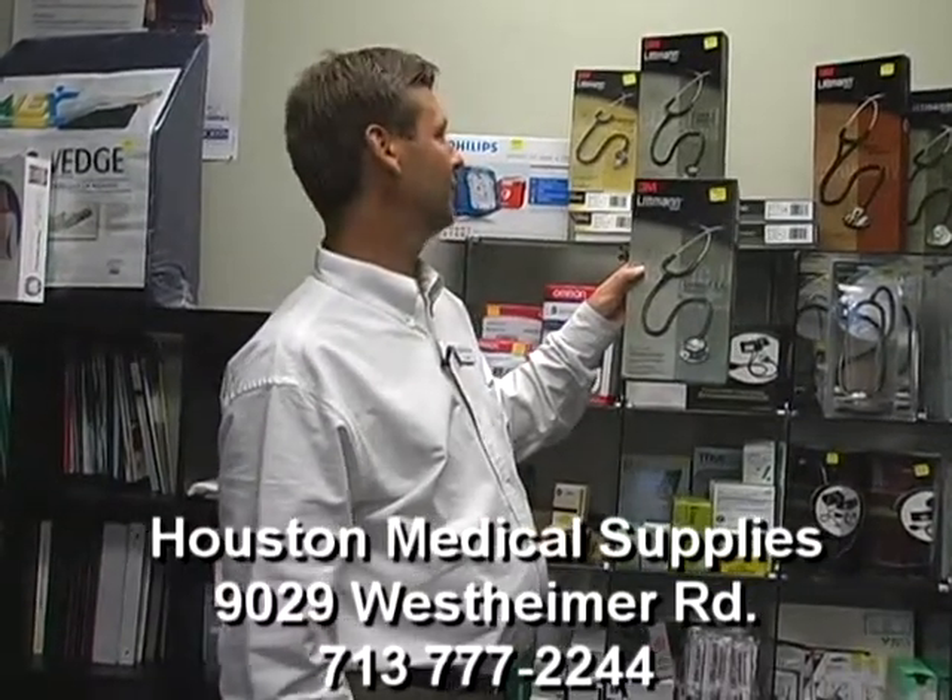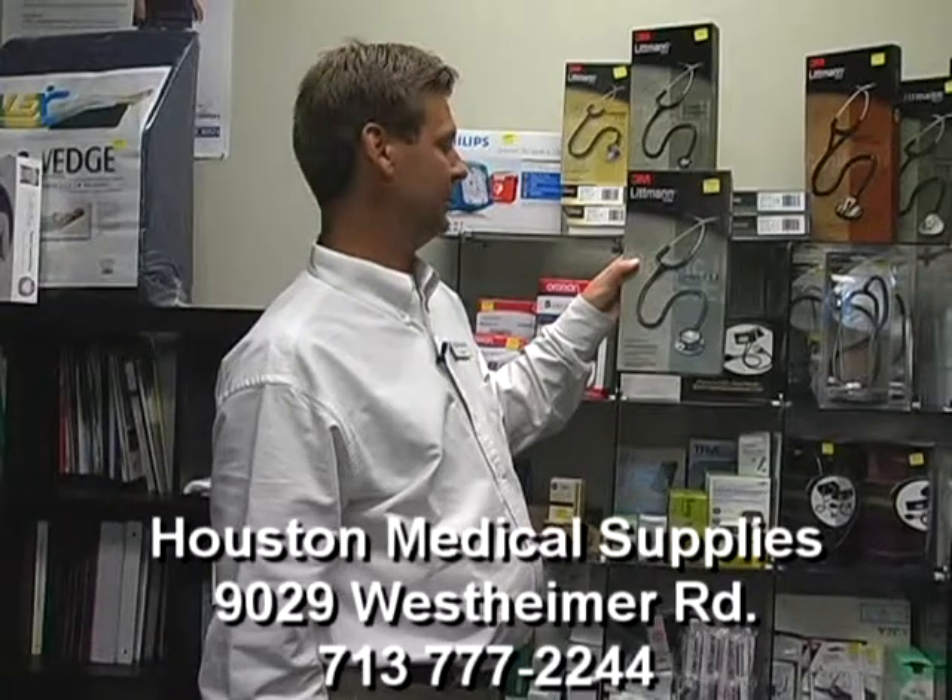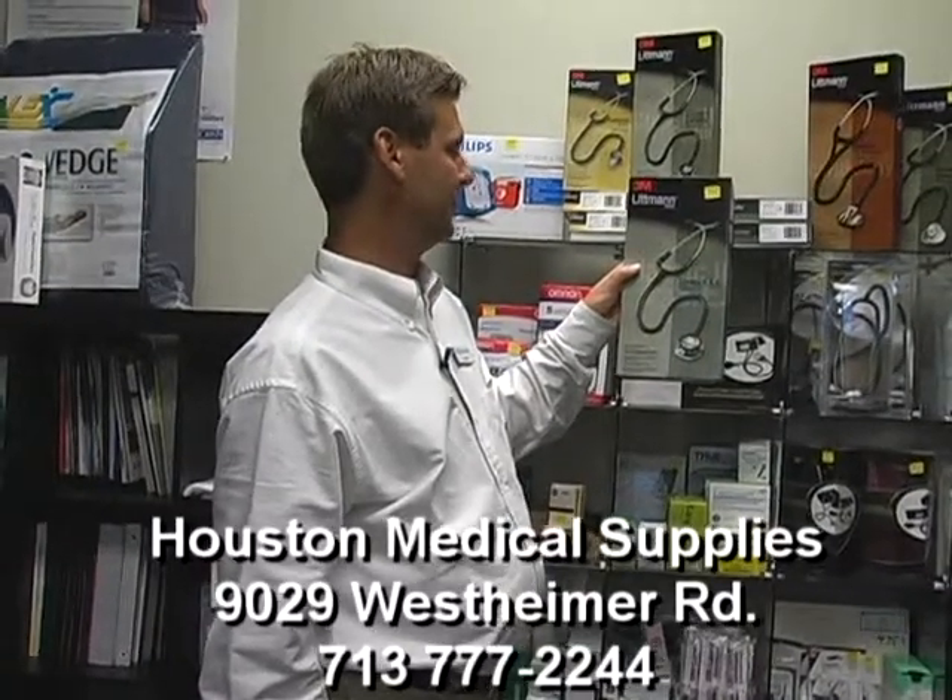We have many varieties. Come and get one. They are very affordable.